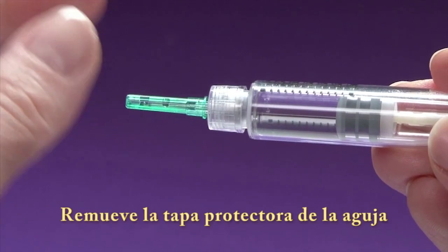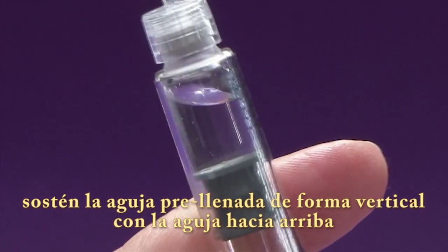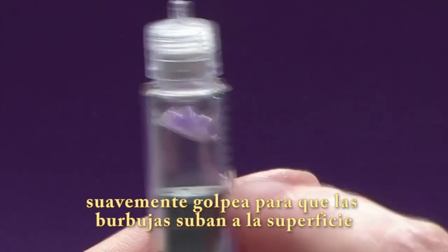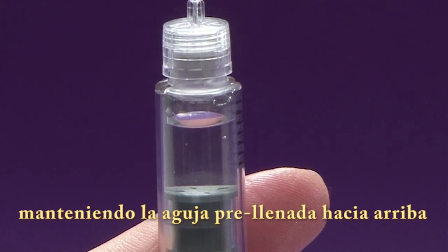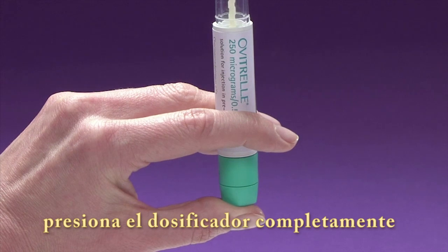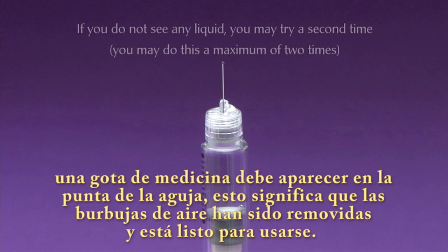Remove the inner needle cap. Hold the pen with the needle pointing upwards. Gently tap on the drug reservoir to allow the large air bubble to rise to the top. It is normal for a few small air bubbles to remain. Keeping the needle pointing upwards, push the dose setting knob in completely. A small drop of liquid should appear at the needle tip. This means that the large bubbles have been removed and the pen is ready to use.